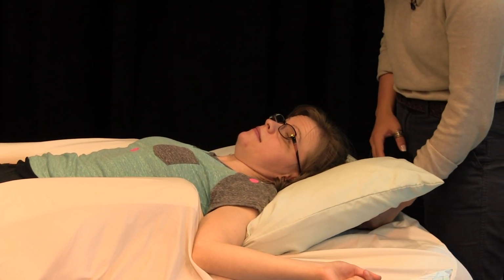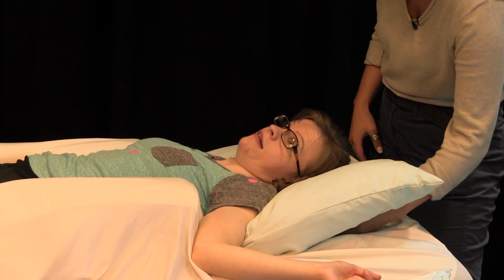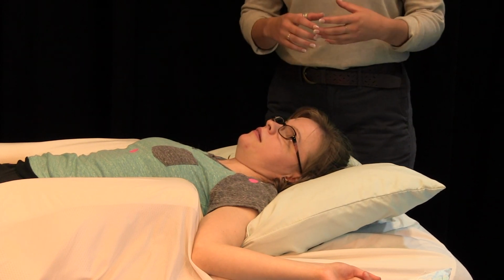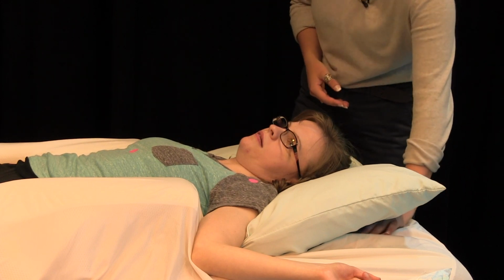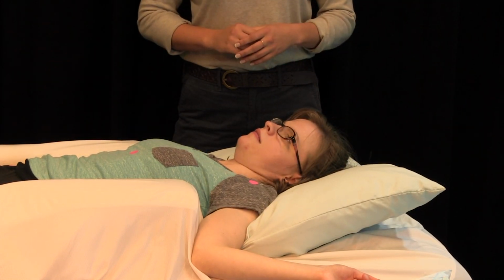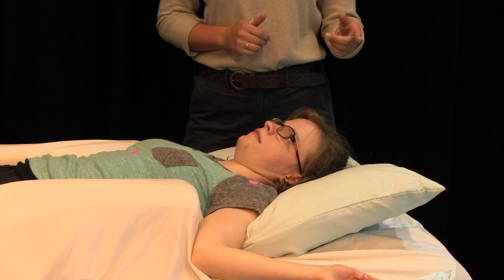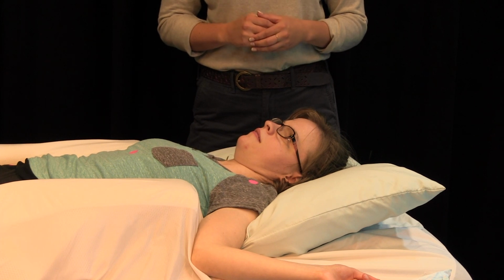How does that feel? That's good. Okay. We're not rolling as much. Okay. And anytime these supports are added, you may need to use a larger support or a smaller, depending on the user's comfort. The goal is for the user to look directly forward towards the ceiling rather than looking to the walls. These supports can help align the neck for both head rotation and tilt.